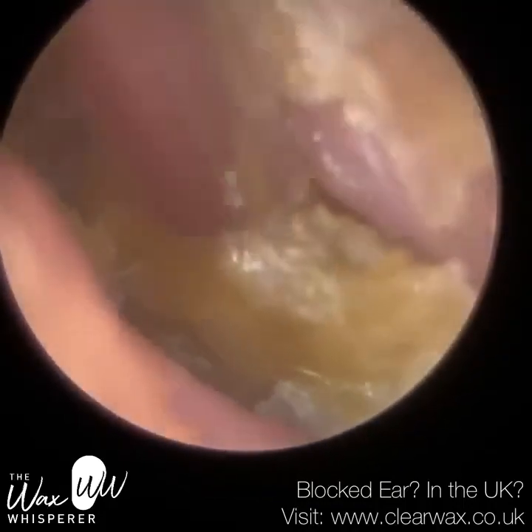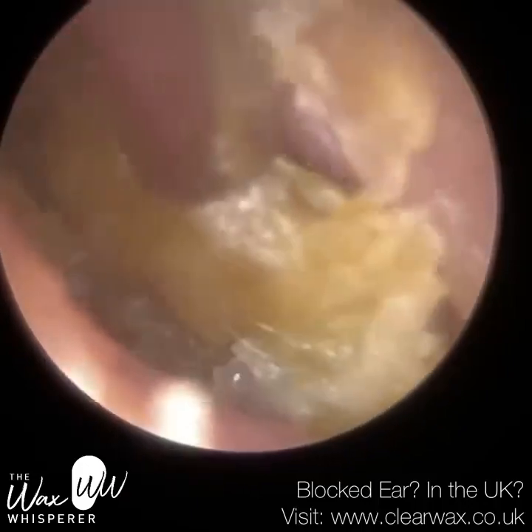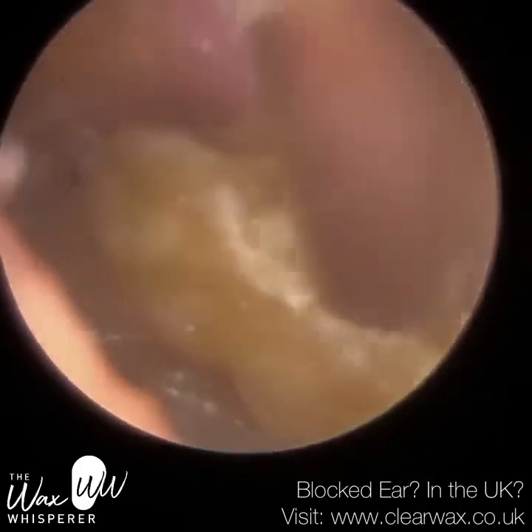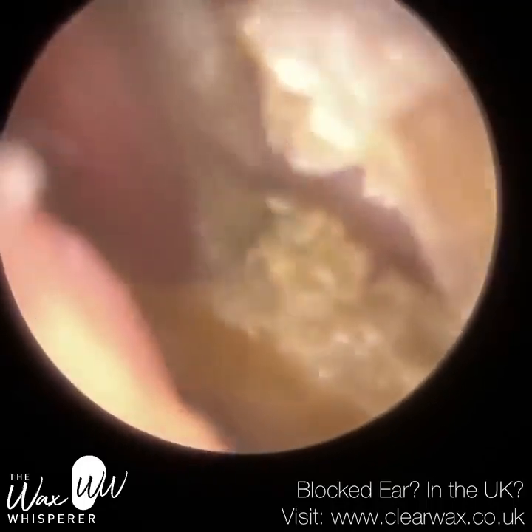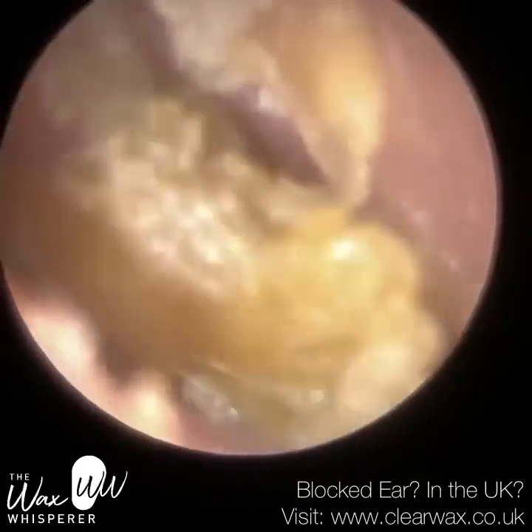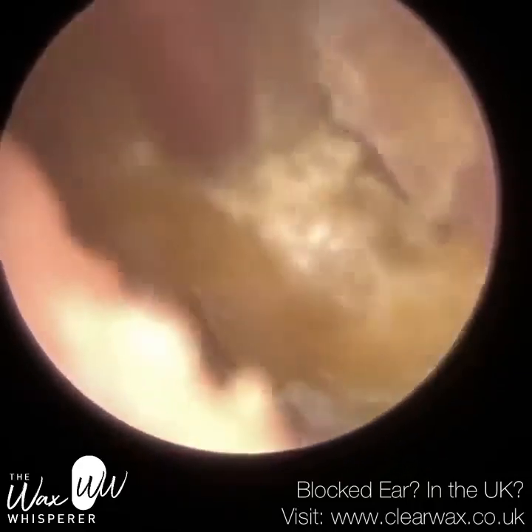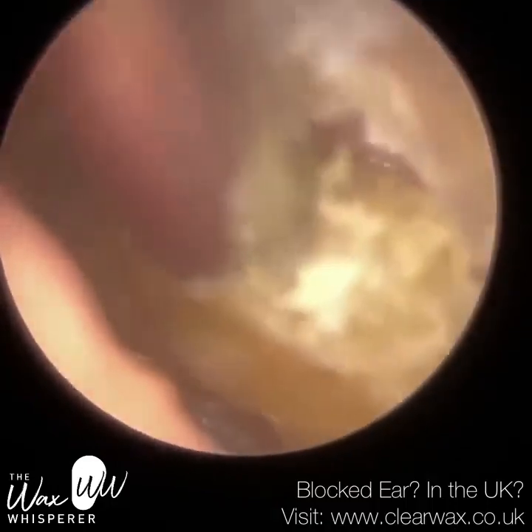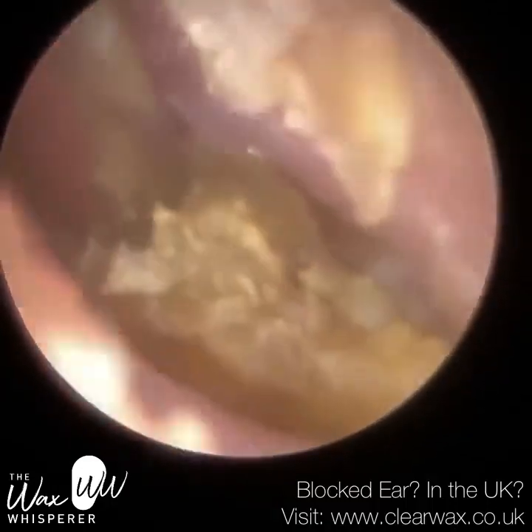When we're suctioning, the fluid within the cells of the auditory canal get attracted by the suction probe. So in essence, the suction probe begins to suction the ear canal, and the ear canal collapses. It tries to enter the tip of the suction probe, and it causes great difficulty in entering the ear. It is quite painful for the patient as well when the ear canal collapses.